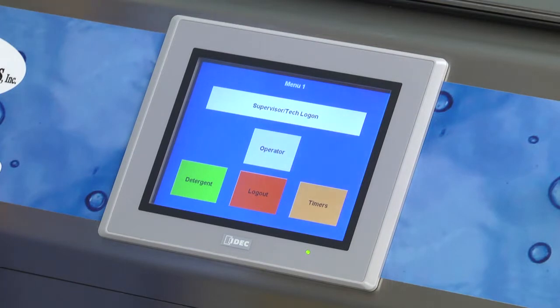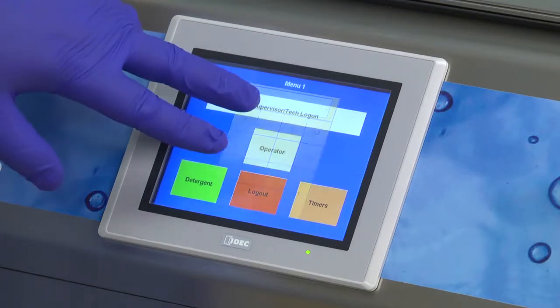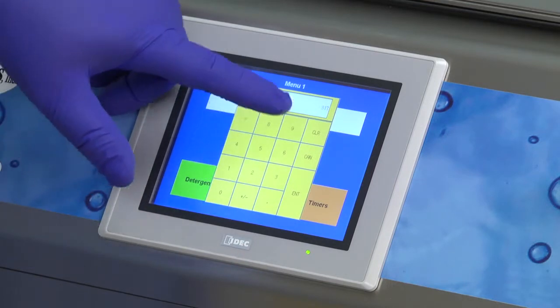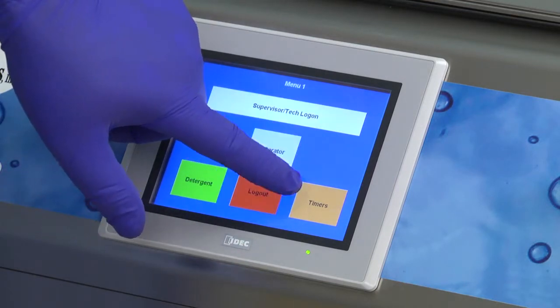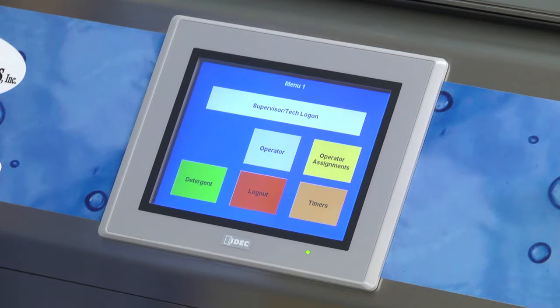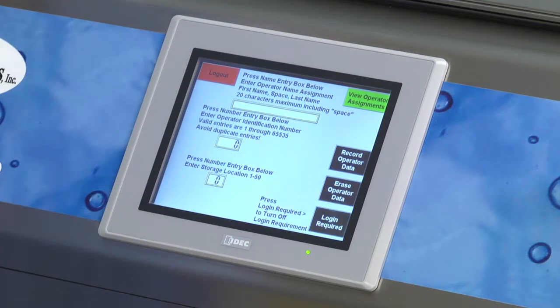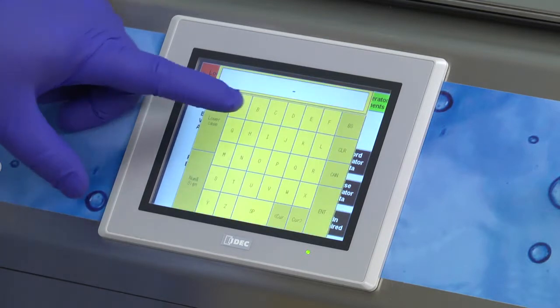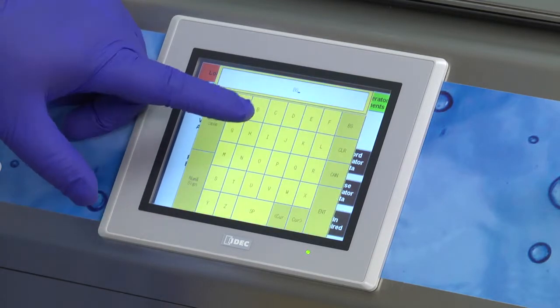To add and remove assigned operators in the system, select the Supervisor Tech button. Enter the code 3179 and press Enter to access this menu. To view a list of operators and their login information, press the Operator Assignments button. Up to 50 operators can be assigned logins for each machine. To create or delete an operator login, press the Name Entry box and type their name using the keypad, then select Enter.